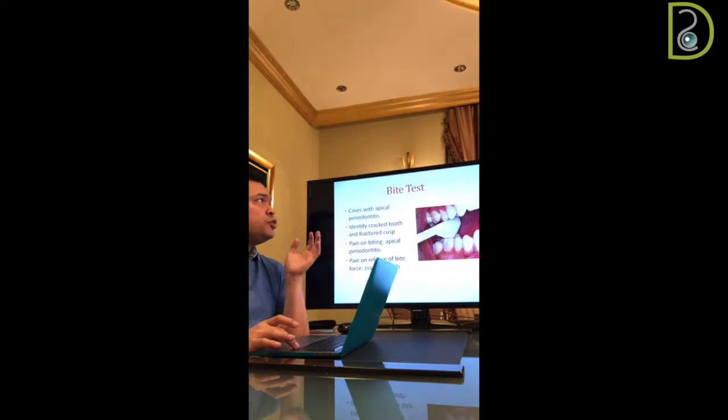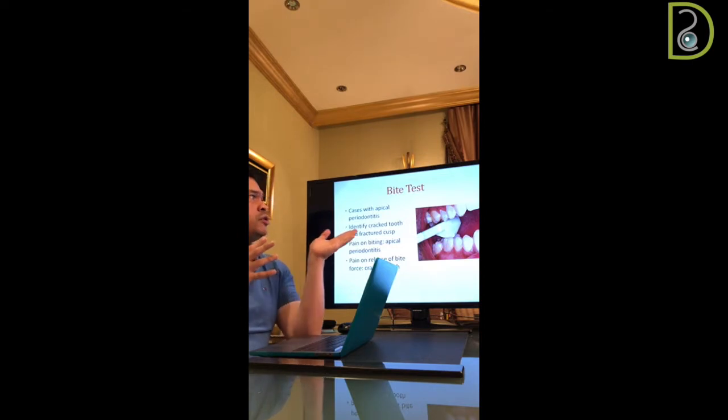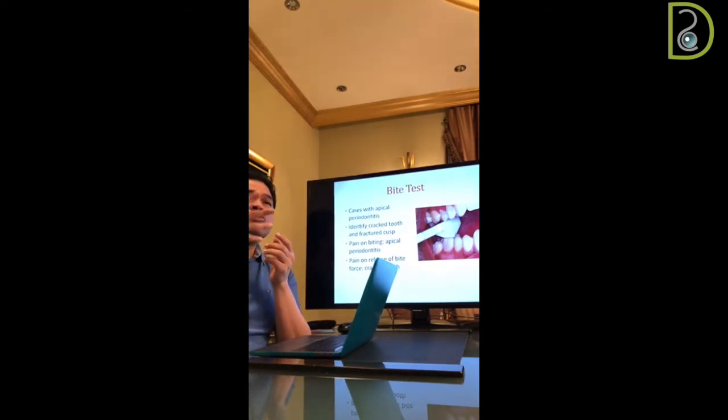Some tools make our examination easy. It's what we call the bite test. For the bite test, usually we use what we call a tooth slooth. You ask the patient to bite, and you have to see.